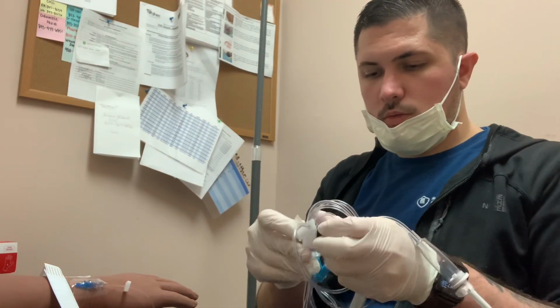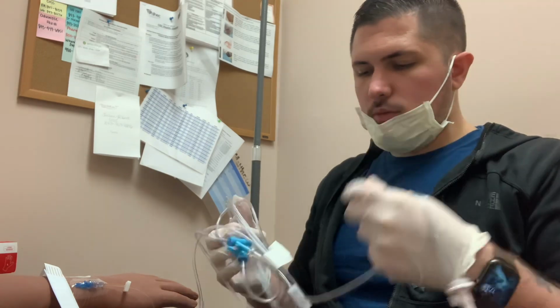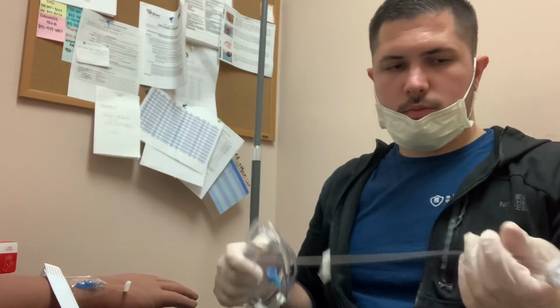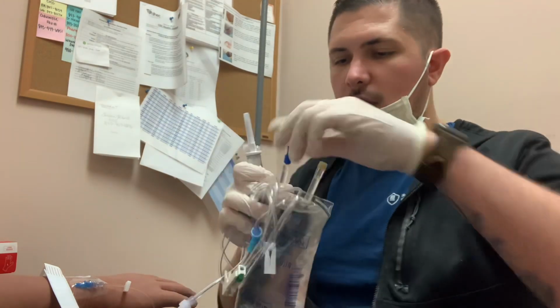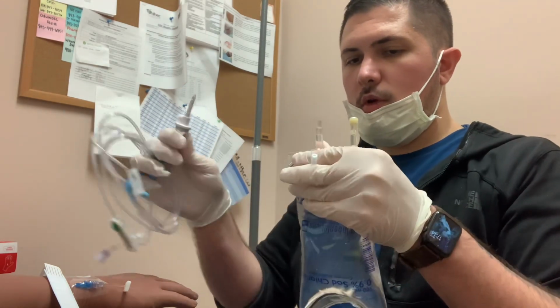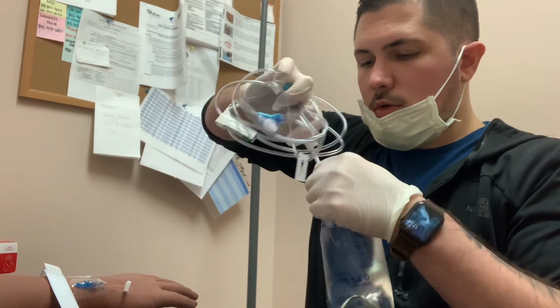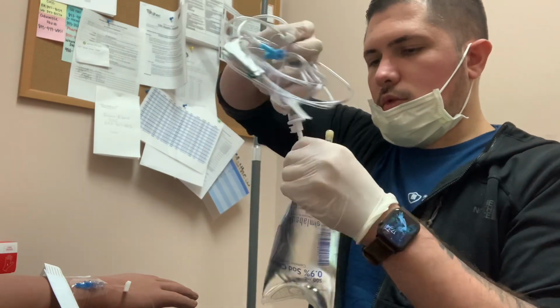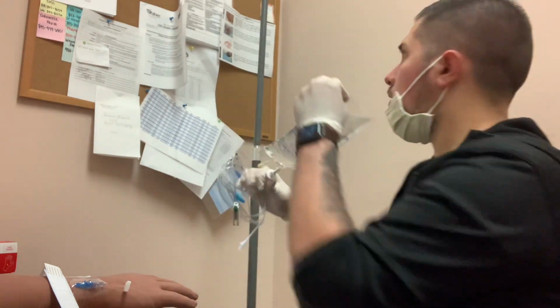We're going to scroll the clamp down. Alright. Without touching the spike, we're going to invert the bag. We're going to take the blue tab off. With the bag inverted, we're going to spike, and the clamp is closed, so now we're going to hang it.